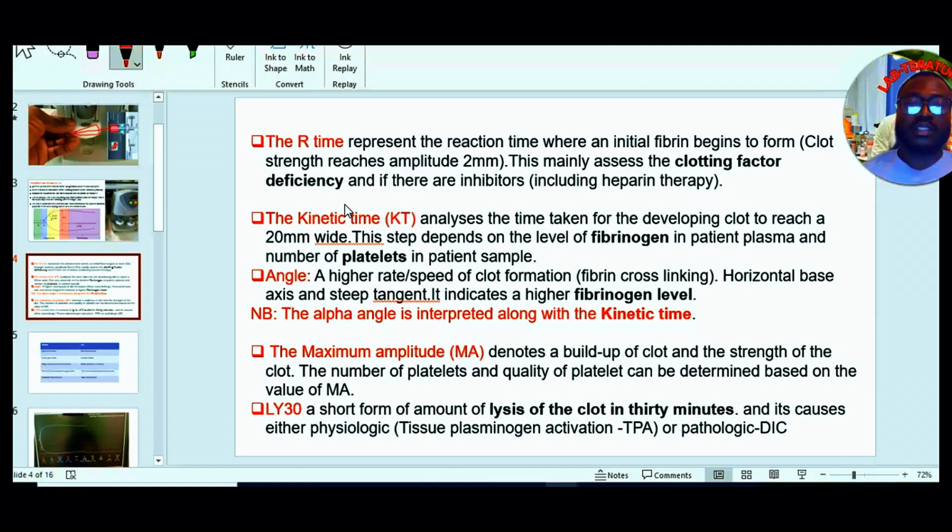And not forgetting this, some people are predisposed to thrombosis. We say they are in a hypercoagulable state, probably due to cancers or thrombophilia. So these patients also have clotting occurring within their system, and they can have their clotting factors either already consumed or activated in the course of a test. So we can interpret it as well. We will have a list of graphs that we are going to explain based on these things.